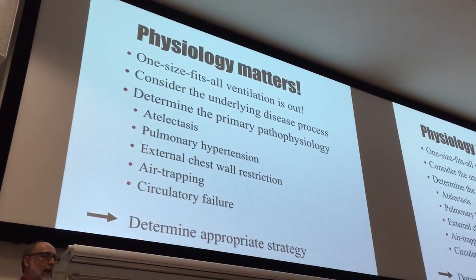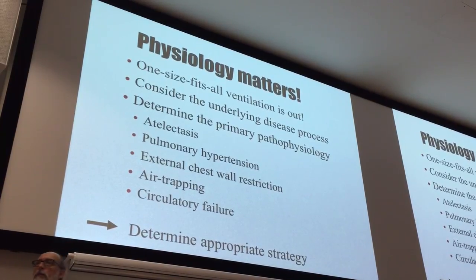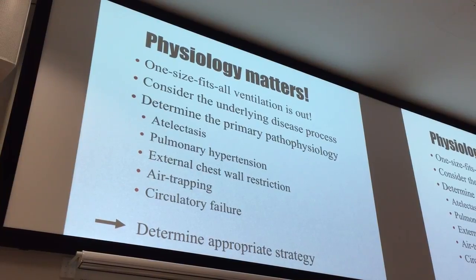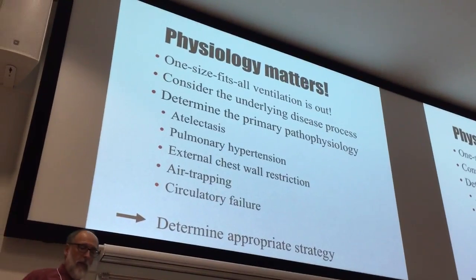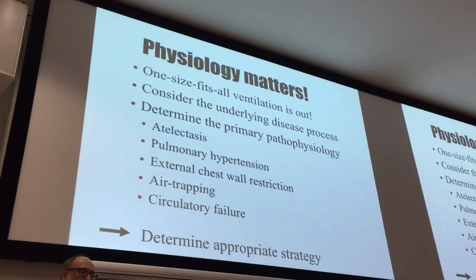So physiology matters. Everybody would like to have a simple formula. Everybody wants, how do you use this ventilator? And my answer, just as David's, is it depends. Who is your patient? What's the disease process? What's the primary pathophysiology that I need to address?